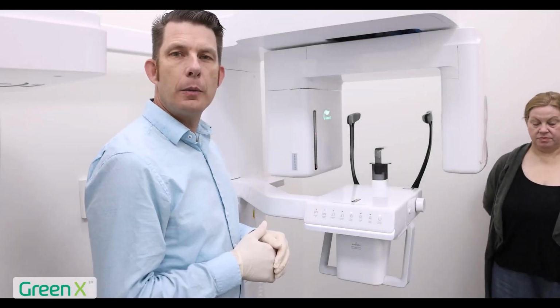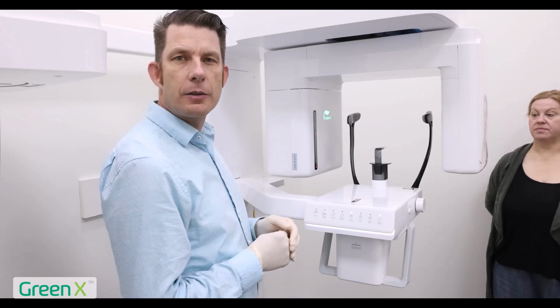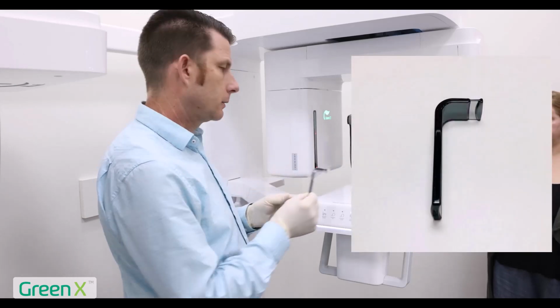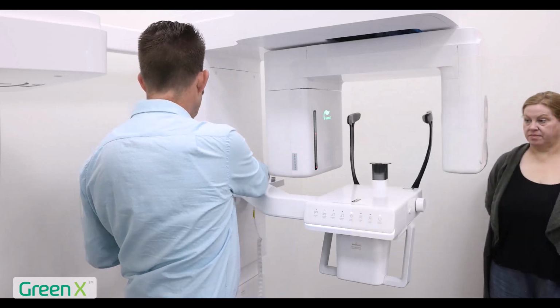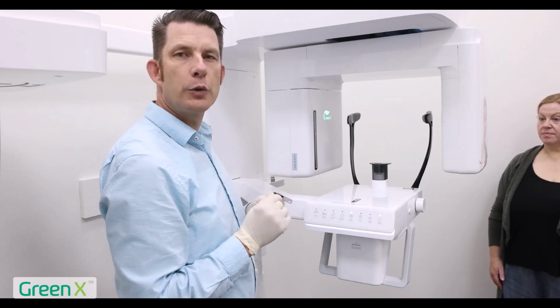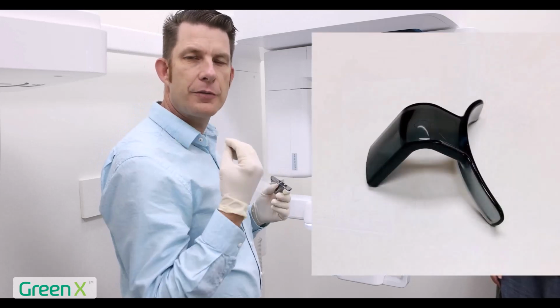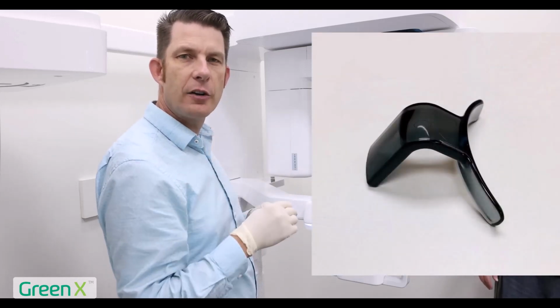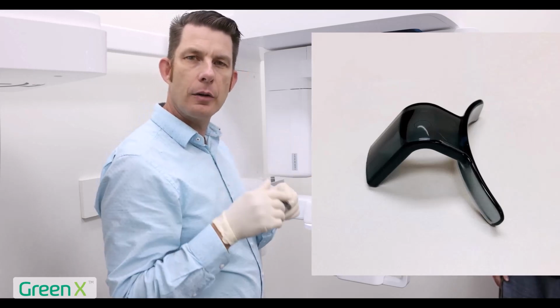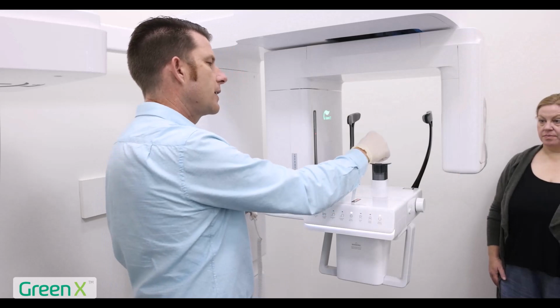Let's look at some patient position accessories. The Green X includes the bite stick. We also have the edentulous cup, which will be utilized if we have a patient that's fully edentulous, maybe missing their anteriors, or cannot get their anteriors biting in the bite stick groove. To demonstrate this, we're going to put our edentulous cup in.